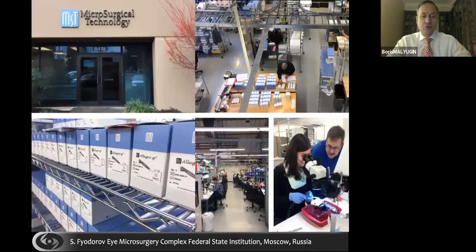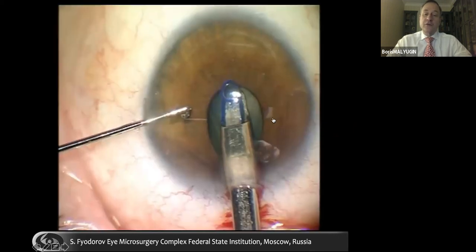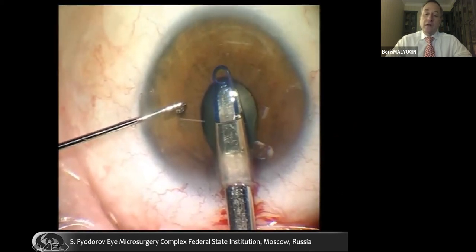And we partnered with MST to produce these nice devices, which come in different sizes, 6¼ and 7 millimeter, with a special holder and a special injector that are used to insert and remove the ring in and out of the eye.